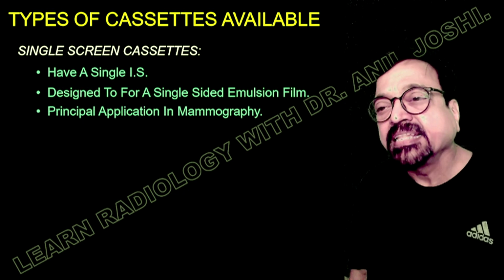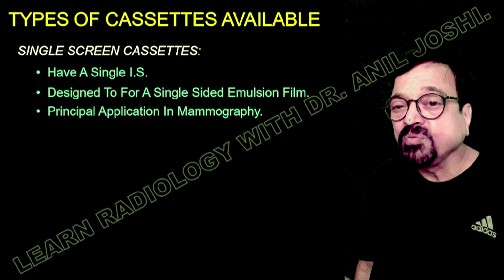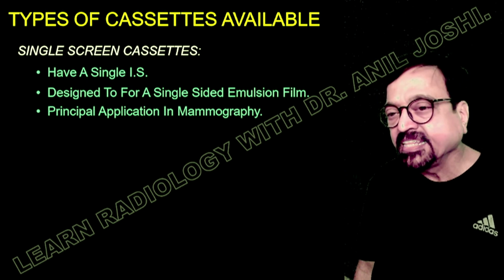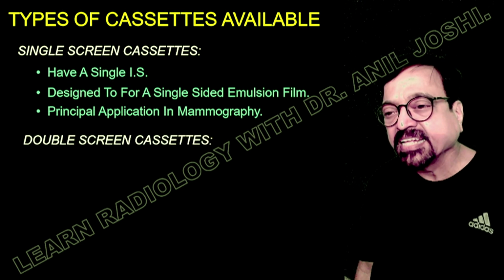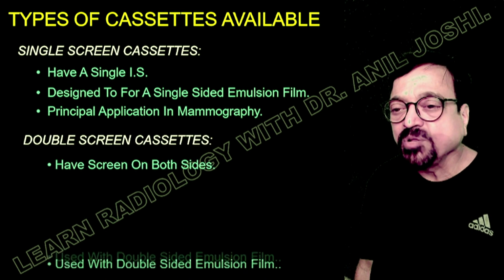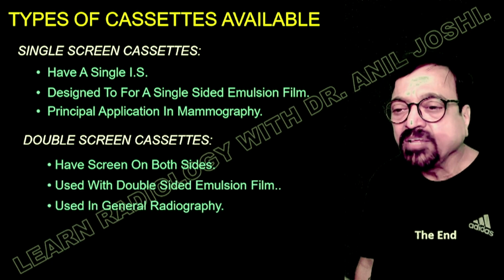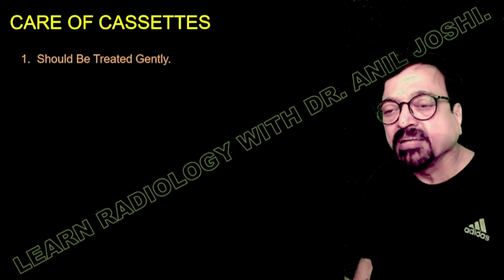It is used in applications like mammography, where we need a single screen because we do not want the film to get unsharp. Small calcifications should be clear, and the sharpness of the image should be optimum. Double screen cassettes have screens on both sides, are used with double-sided emulsion films, and are used in general radiography, where we can save radiation because of the double-sided emulsion.